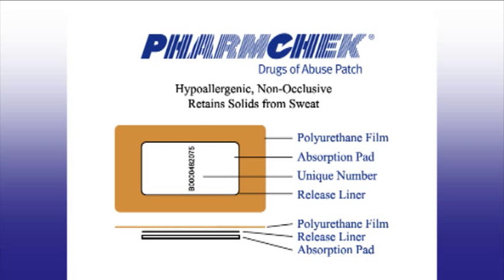Between the adhesive and the absorbent pad is the release liner. The release liner allows the absorbent pad to be removed from the sweat patch easily after the patch has been worn. Each FarmCheck Sweat Patch has a unique number printed on the underside of the transparent covering, and this number is used to track the sweat patch on the chain of custody form.